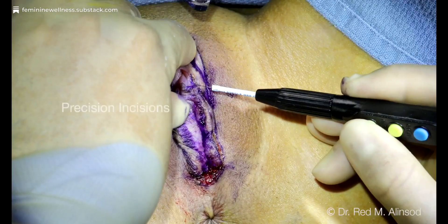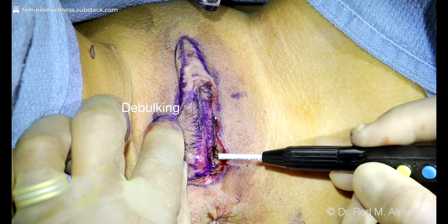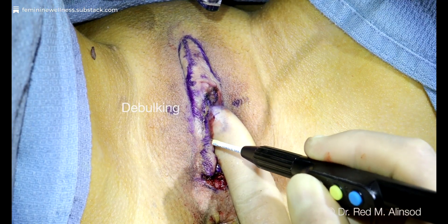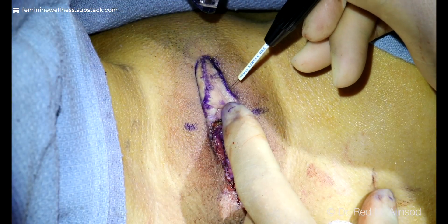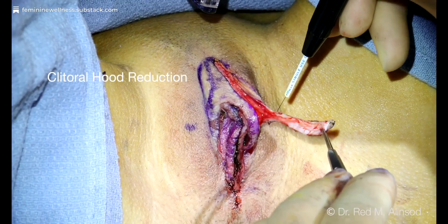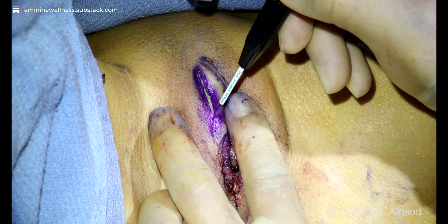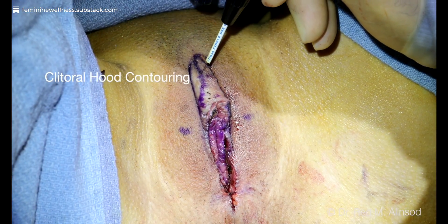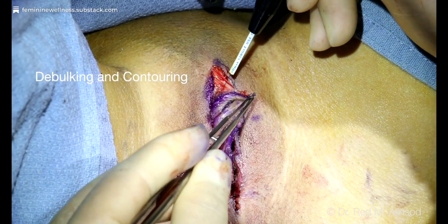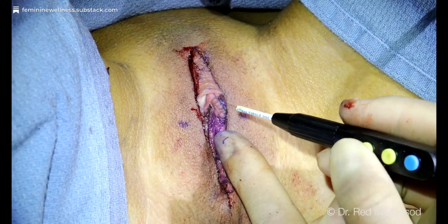You can see the precision to debulk labiaplasties that did not go well — precision incisions right underneath the clitoris and right on the frenulum. Here I'm debulking a great deal of tissue from a prior labiaplasty, incising at a 45-degree angle into the labia from both the lateral and medial edges. Here I'm reducing the width of the clitoral hood — a pretty good size wedge excision — and you can do this with both the unipolar or bipolar. This is clitoral hood contouring, not just reduction, so it looks quite precise. We've reduced the width of the entire upper portion of the clitoral hood by about two-thirds in lateral width.